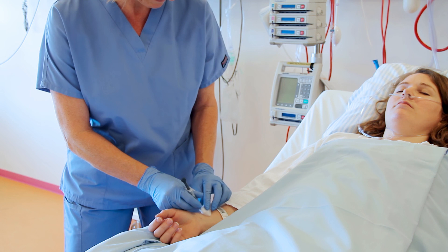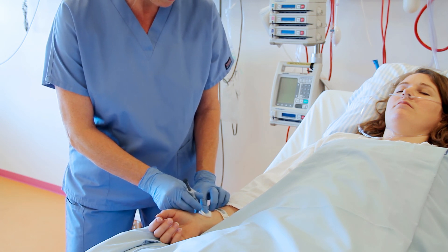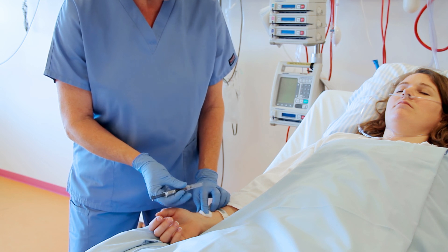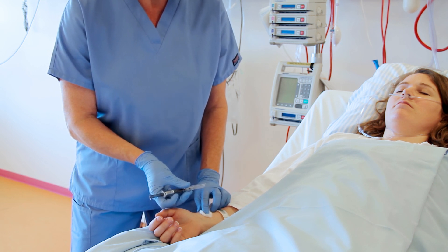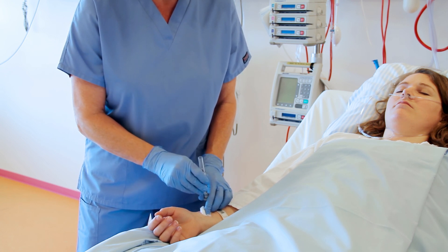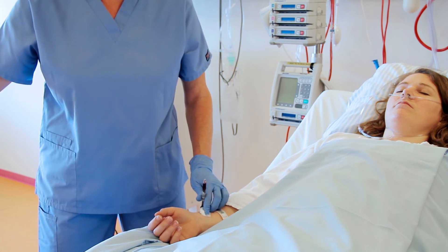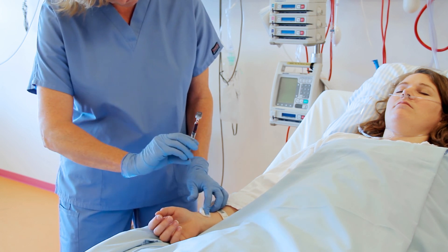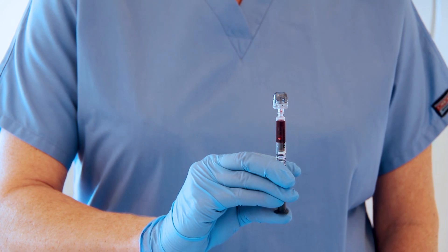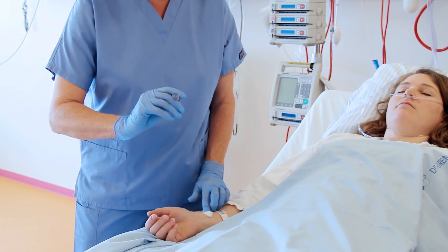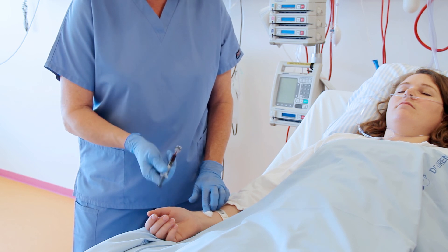Withdraw the needle and apply pressure to the puncture site. Remove the needle using a safety device. Gently tap the syringe so that air bubbles are forced to the top. Expel air bubbles through the tip cap or into a piece of gauze. Mix the sample thoroughly to dissolve the heparin.